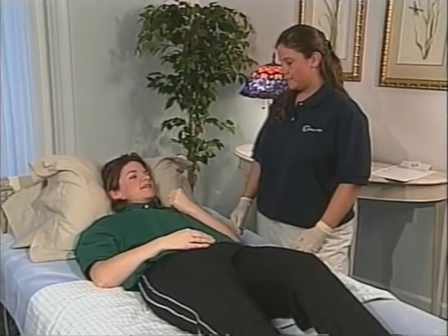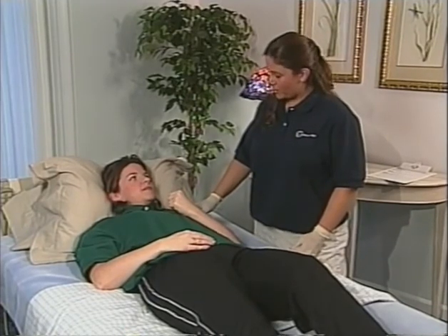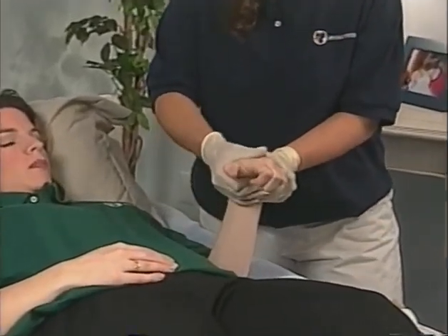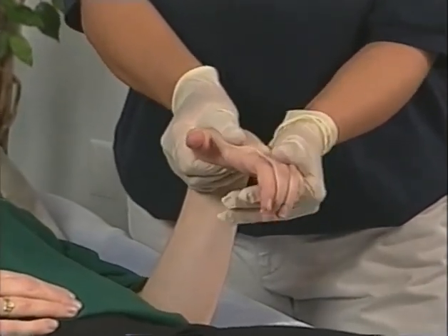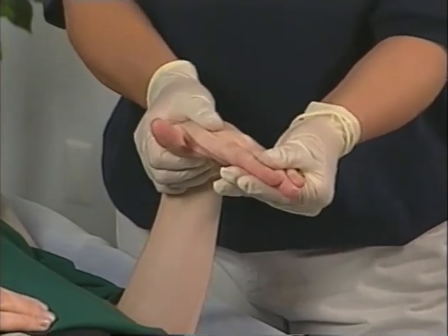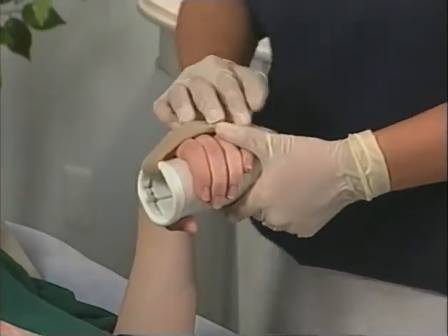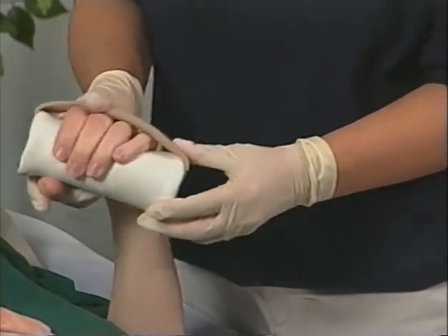When applying a hand cylinder or splint, first explain the procedure to the client. Do some range of motion on your arm, okay? Okay. Flex the wrist or bend it downward. Bring the thumb out to the side, not back, and gently bring the fingers out from the palm, taking care not to touch the palm, which triggers a grasp reflex. Feel okay. Apply the hand cylinder and fasten the straps over the base of the fingers.